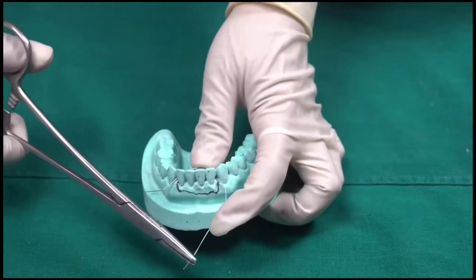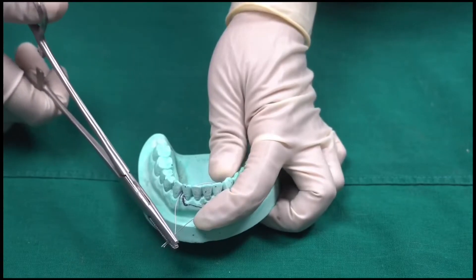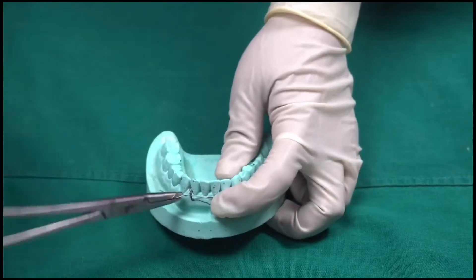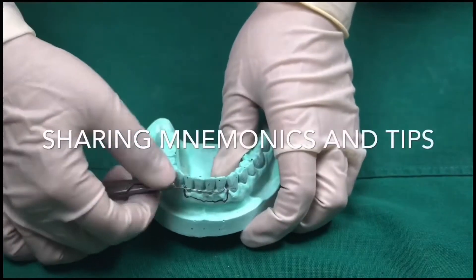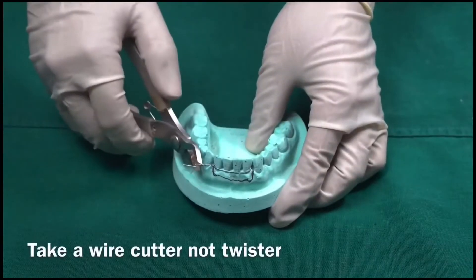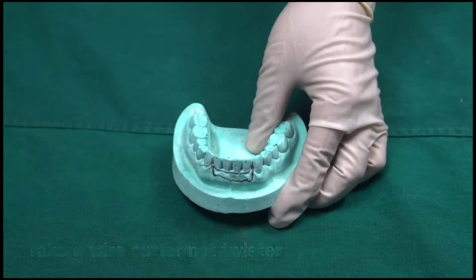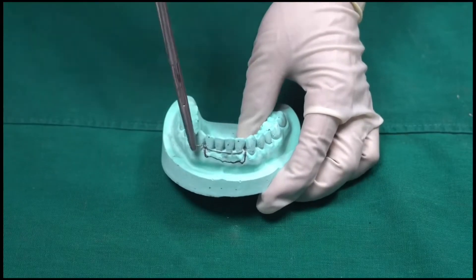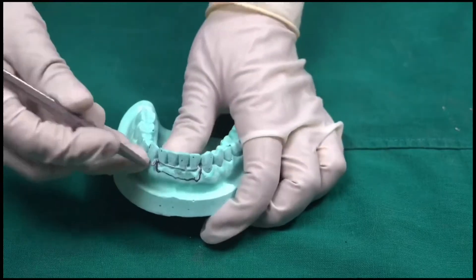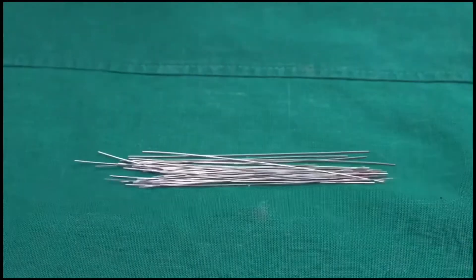Pull the buccal wire with the lingual wire and then twist both the wires together. Take a cutter and cut the wire short, then tuck the wire with a needle holder into the interdental region. We are now done with the lingual and buccal wires which have been tied together.